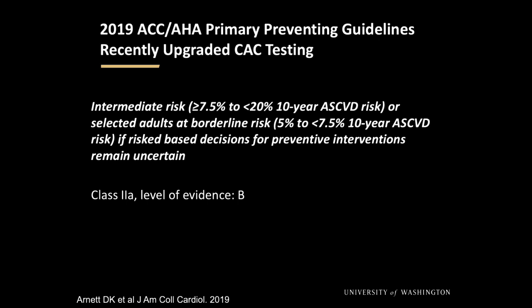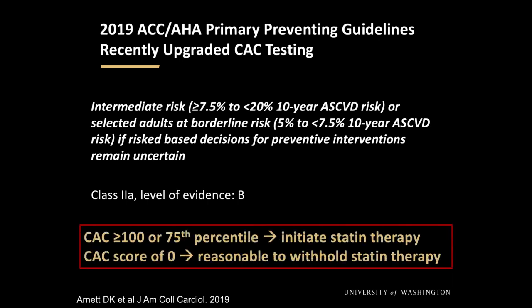considered. And they give a level of evidence B, and then if you get the scan and the score is above 100, or it's greater than the 75th percentile, then the recommendation is to initiate a statin. And if the score is 0, then it'd be reasonable to withhold statin therapy.